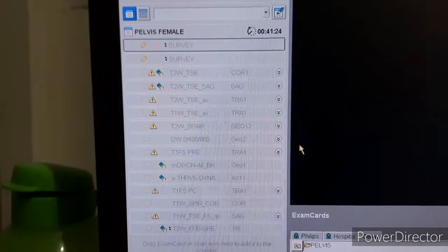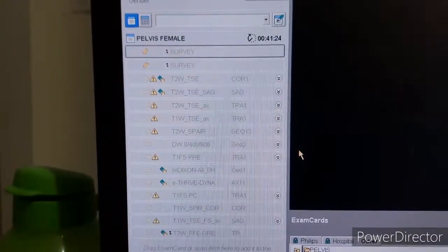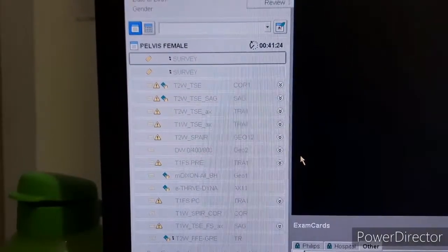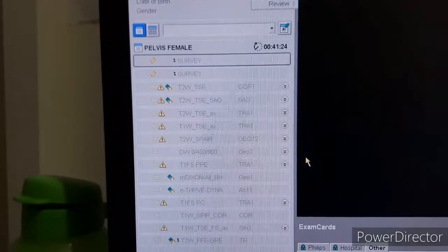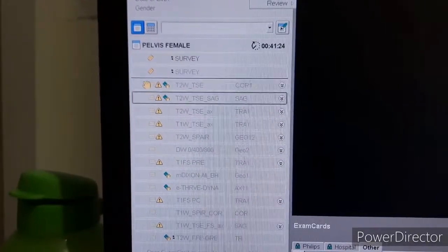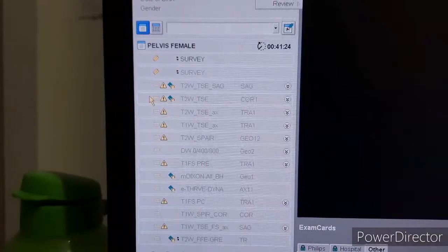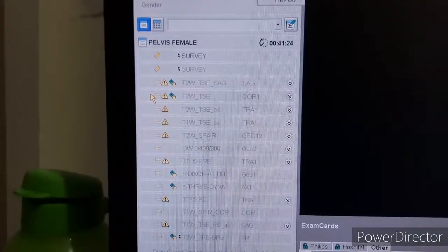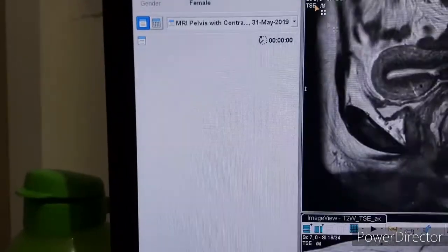Here is the protocol which we follow. First we have to take a three-plane localizer. The patient position — we can take patient head first or feet first depending on the comfortable position. Then first we take the three-plane localizer, then we take T2-weighted sagittal.